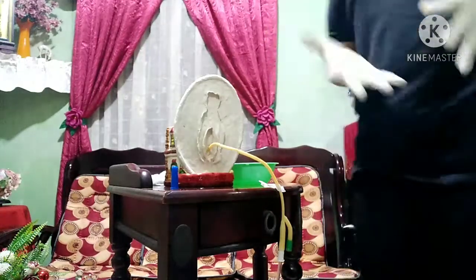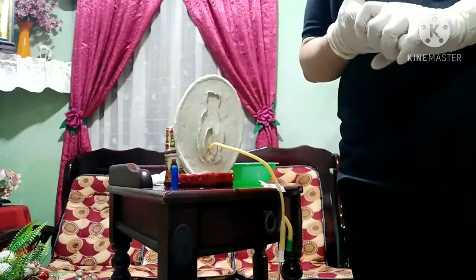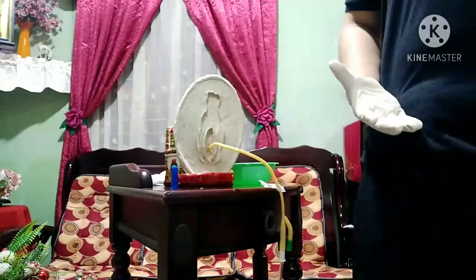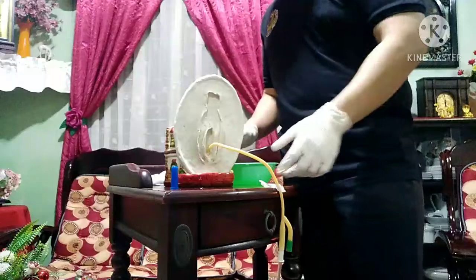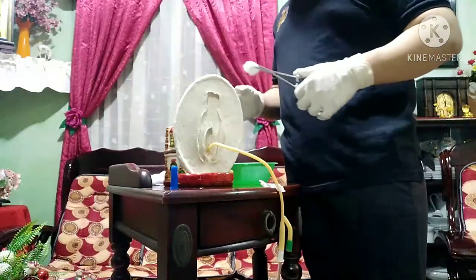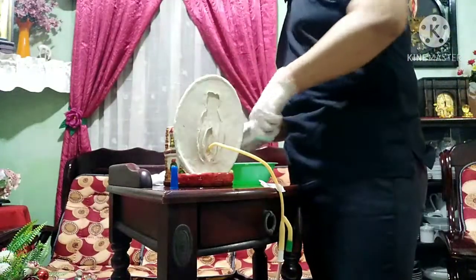So, step 23 po, dries the area. Place a specimen where it's safe from spilling and remove tray and equipment from the bed po. So, i-dry na po natin yung area po na baka po basa or may something po. I-dry lang po natin yung area. So, ganun po ulit.